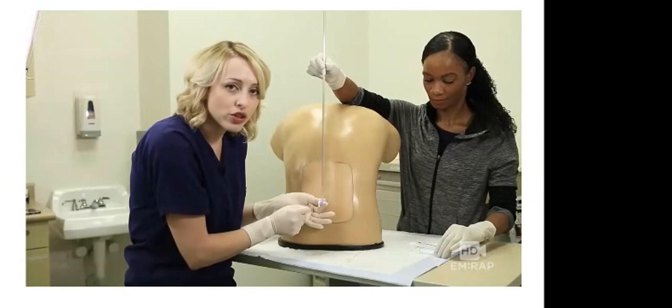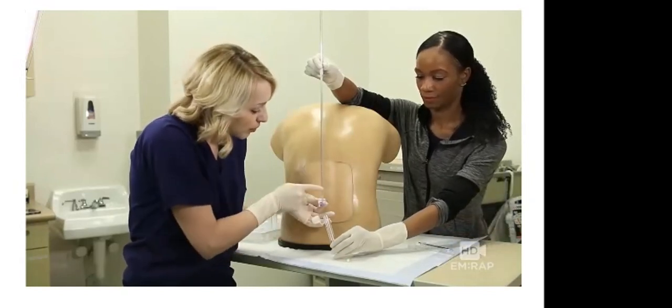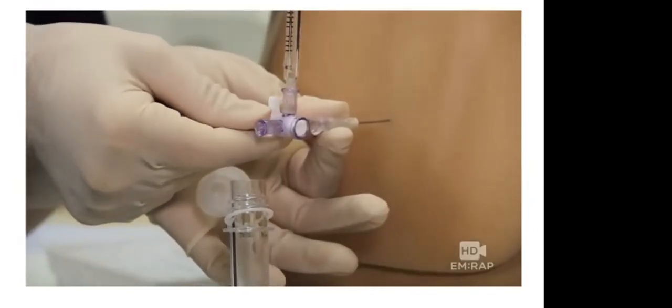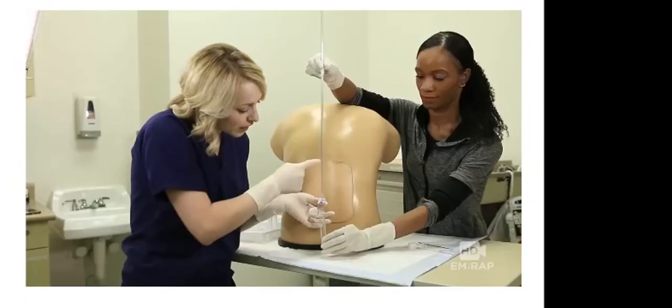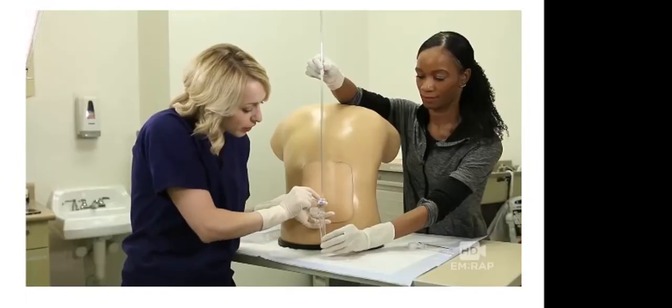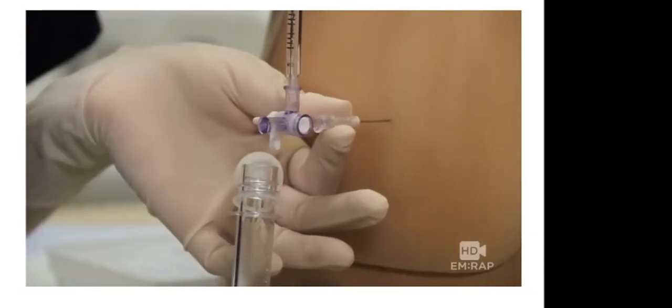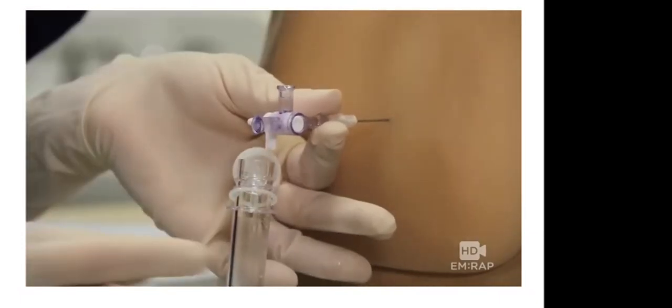Once we have our pressure measurement, we're now going to collect the spinal fluid from the manometer into our collection tube. So you turn the stopcock to open it up. And once it's drained out from the manometer, you can remove the manometer altogether and continue collecting your spinal fluid.